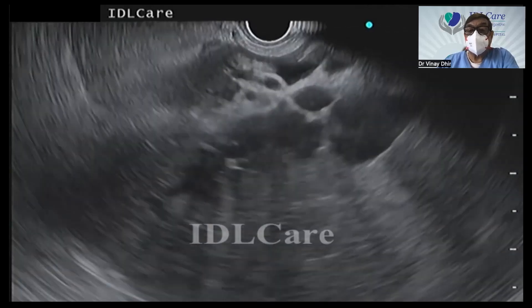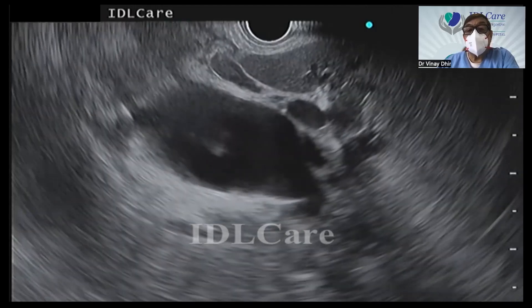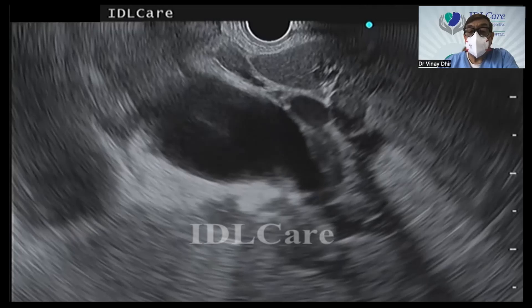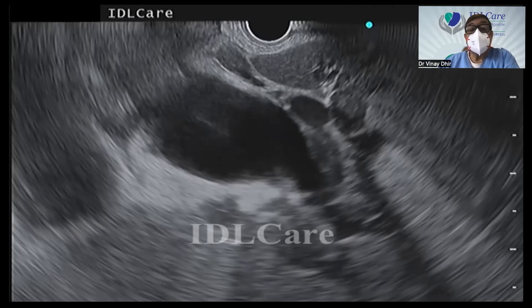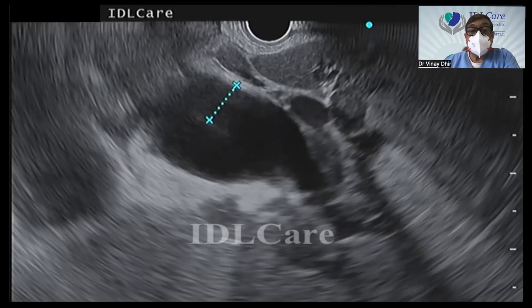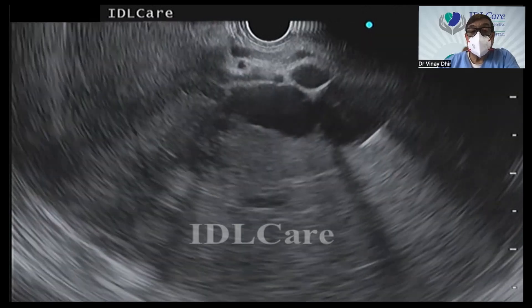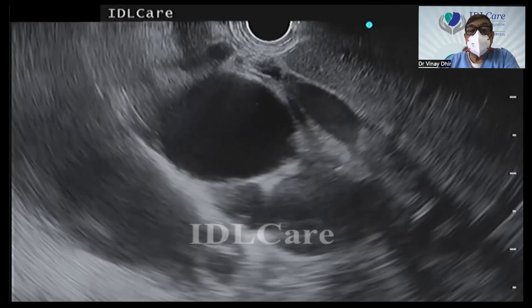Now I have turned my scope clockwise to look at the common hepatic duct. You see hugely dilated common hepatic duct here, so we know there is an obstruction somewhere lower down. Let's measure the bile duct here — this is about 13 millimeters. Hugely dilated bile duct. I'm pushing down with a gentle clockwise rotation.